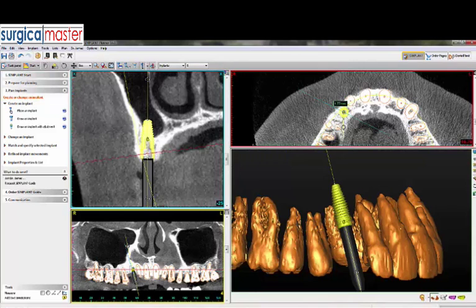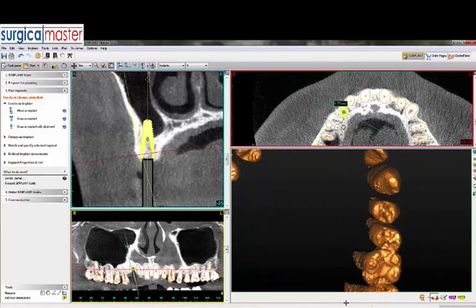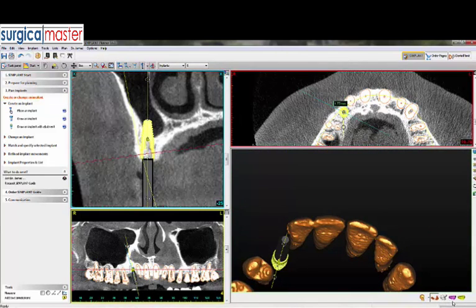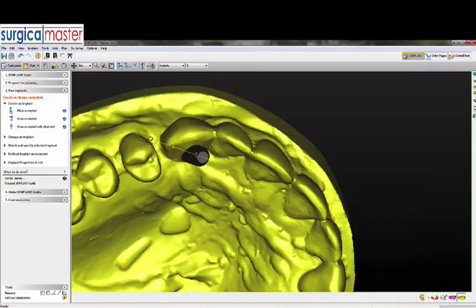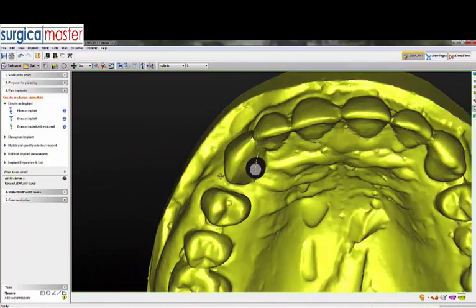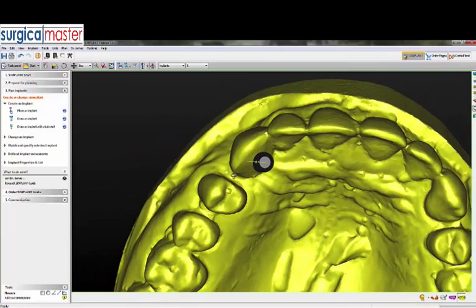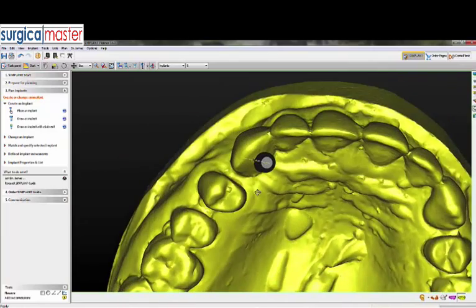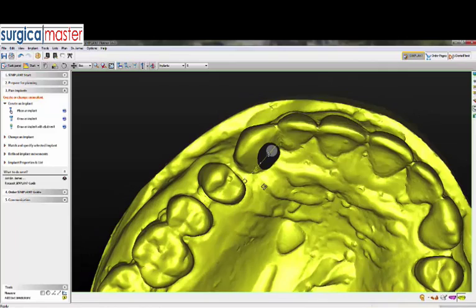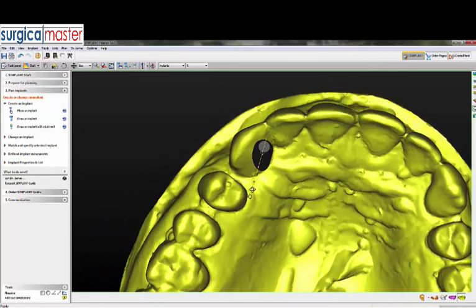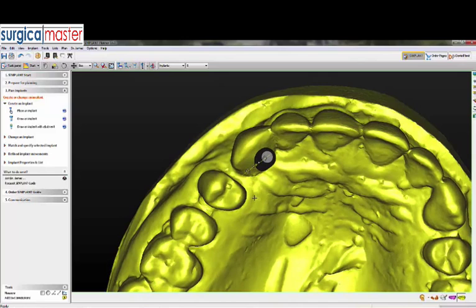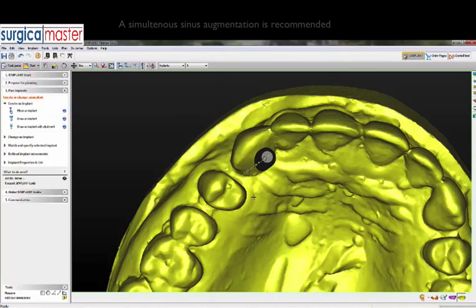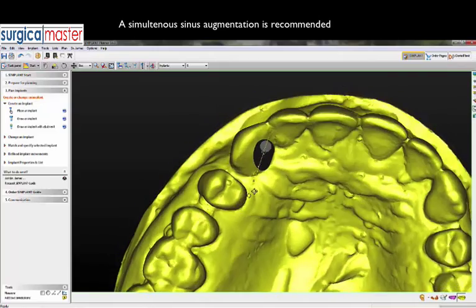Now we have to check what the distal move did to the restorative position. I'll turn on the wax-up again and see if anything was disturbed. Actually, this is a much better position restoratively — it's right in the middle of the tooth, and the trajectory is through the cingulum. That tells me this can be a screw-retained crown, a screw-retained provisional, or at least we have the choice to do it.